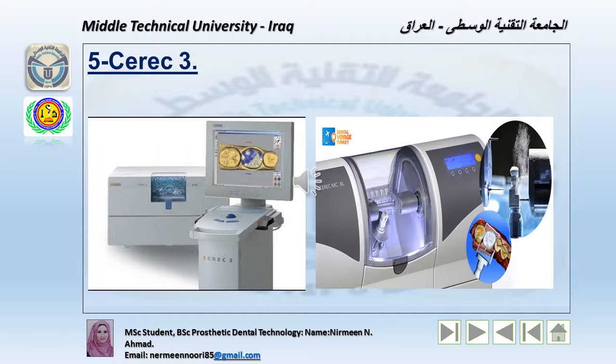While the system is modeling the first restoration, the software can virtually set the restoration back into the virtual cast to provide the adjacent contact while designing the next restoration. The process center is chairside, with an optical scanning machine, custom design CAD program, and fully automatic CAM process.